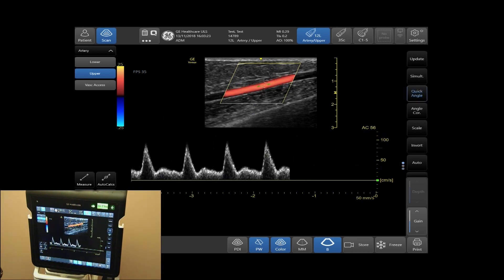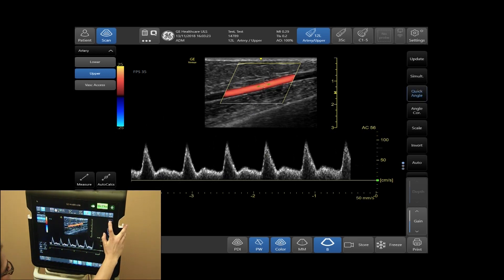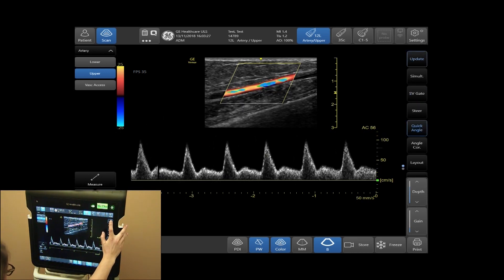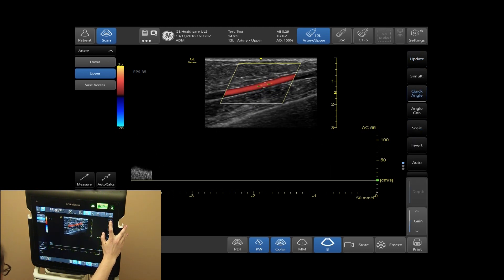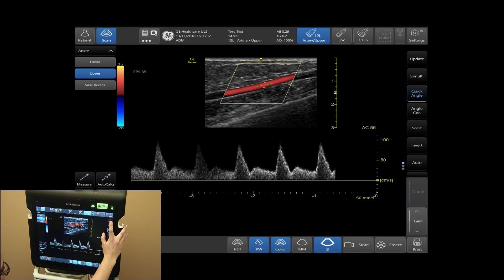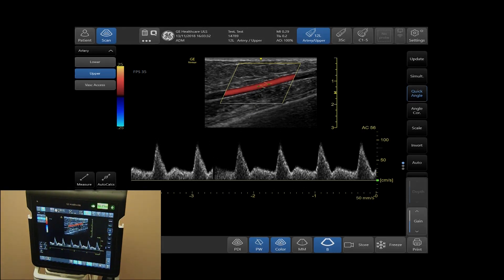Tap your Update tab to toggle between your Live B Mode image and your Live Doppler image.